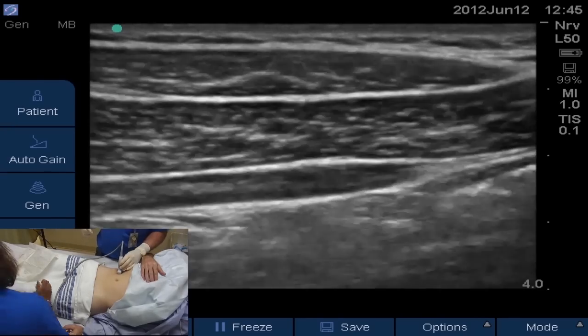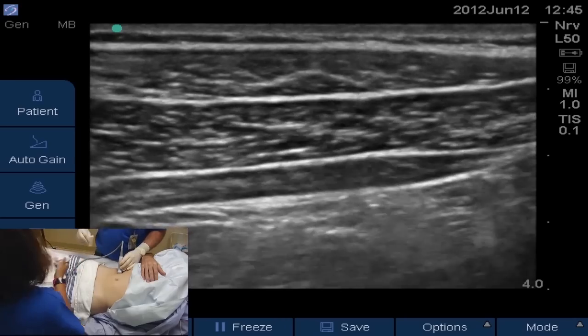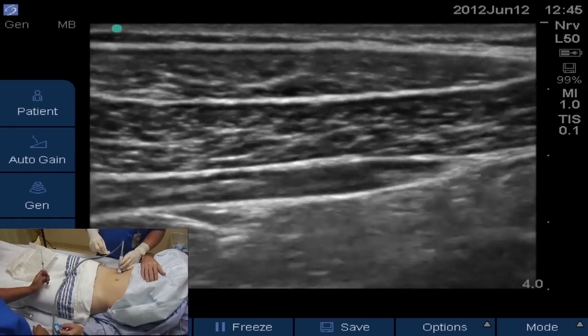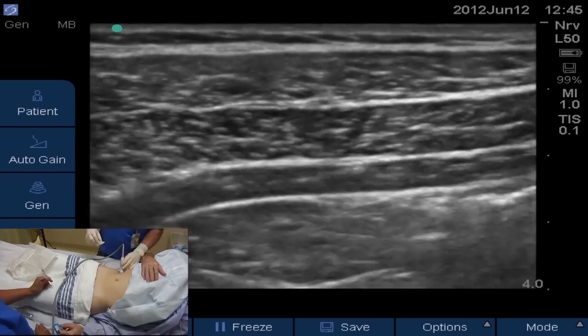This is a classic look. You're going to see this on all patients — it's very consistent. The difference is going to be between the external oblique and the skin, based on the adipose tissue in each patient.